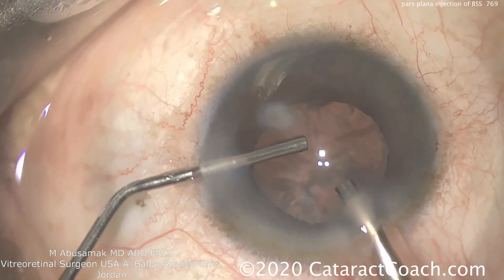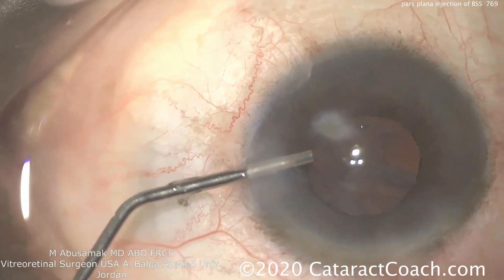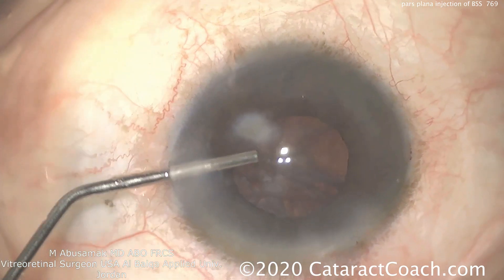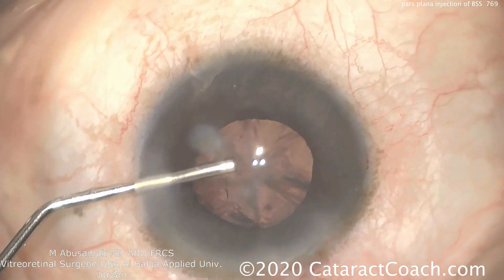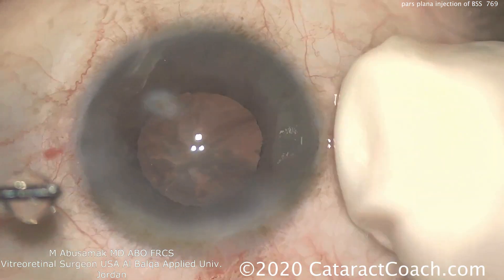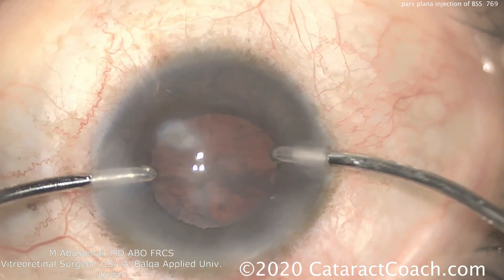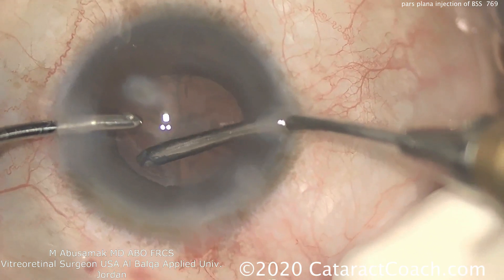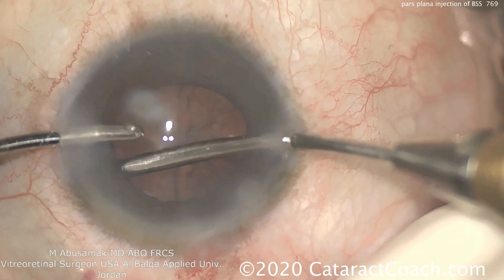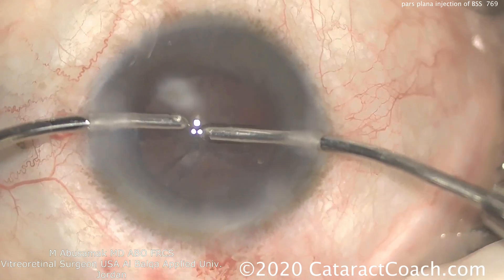There's a tendency for the AC to collapse a little bit, so he's injecting viscoelastic with one hand as he pulls the probe out of the eye. Now it's time for bimanual irrigation and aspiration to clean up the cortex. This bimanual technique allows full 360-degree access to the capsular bag to really clean it up.